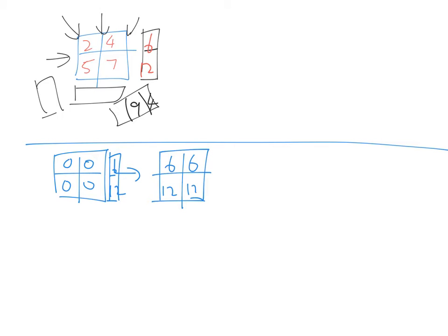And the value that has been absorbed over here is only 1 voxel, which is how much? 5. So then it detects this is absorbed is 5. Since they scan diagonally, they will also add diagonally. So this will be 5, this will be 9, this will be 4. So how you will add is you add diagonally.